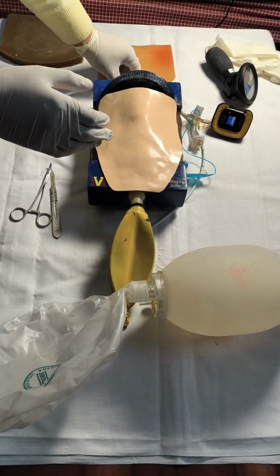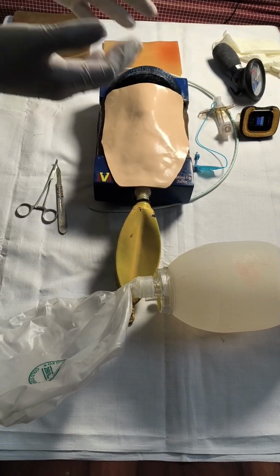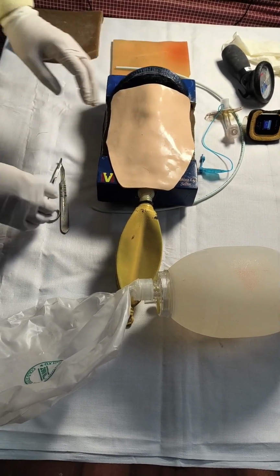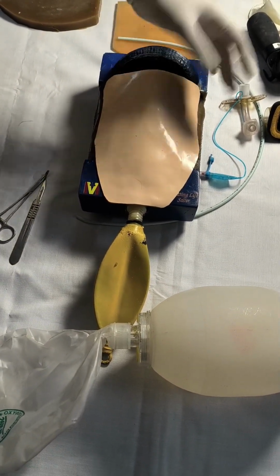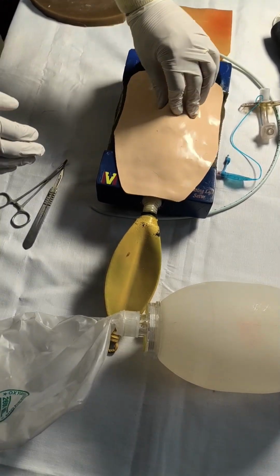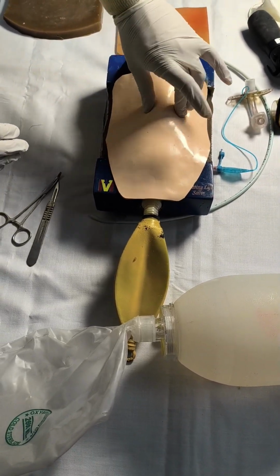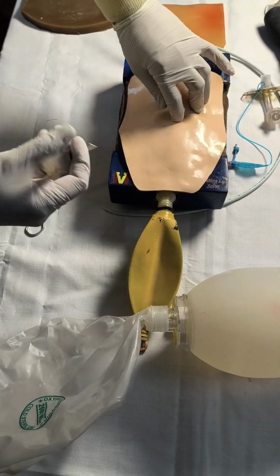The second, which I'm going to demonstrate, is doing the actual procedure. Because I need an assistant, but since I'm doing a deliberate practice, I'll be doing it on my own. So now to the procedure. This is basically a three-finger technique. First, the laryngeal handshake. You try to find out where the larynx is, and now this is the space. These are the two fingers used to stabilize the larynx, and then with the third finger, with your index finger, you feel the cricothyroid space, never leaving the space, and then you give this stab.